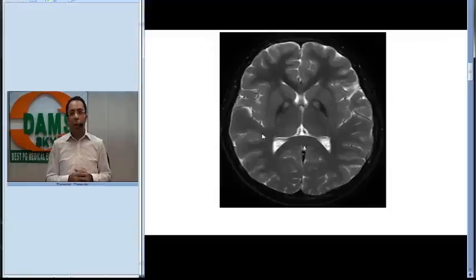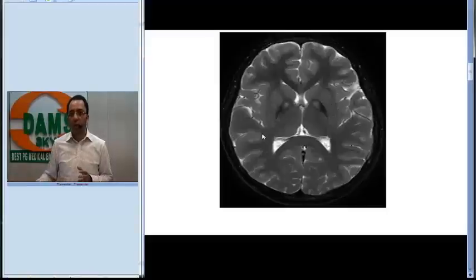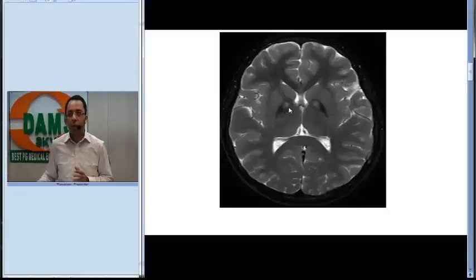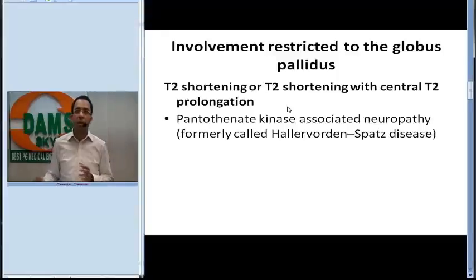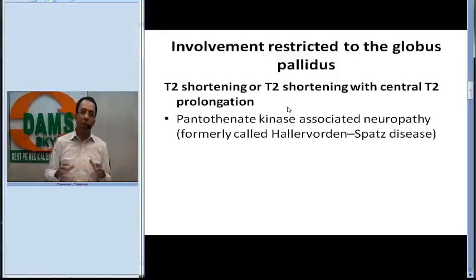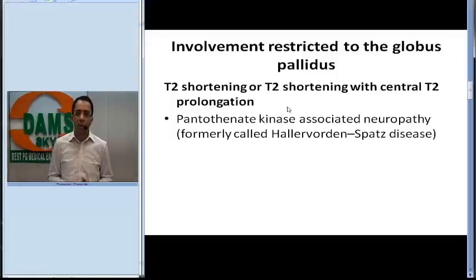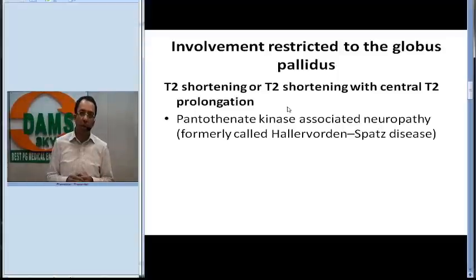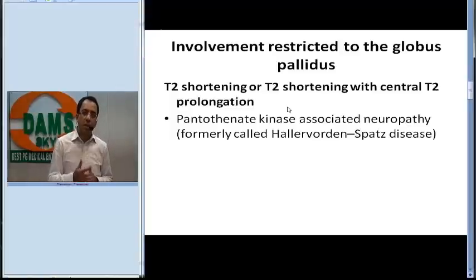In the next T2-weighted MRI image, you can see T2 shortening — hypointensity in the periphery of the globus pallidus with hyperintensity in the center. This means T2 shortening with central T2 prolongation primarily involving the globus pallidus. When we see this pattern, we think of pantothenate kinase-associated neuropathy, formerly called Hallervorden-Spatz disease.